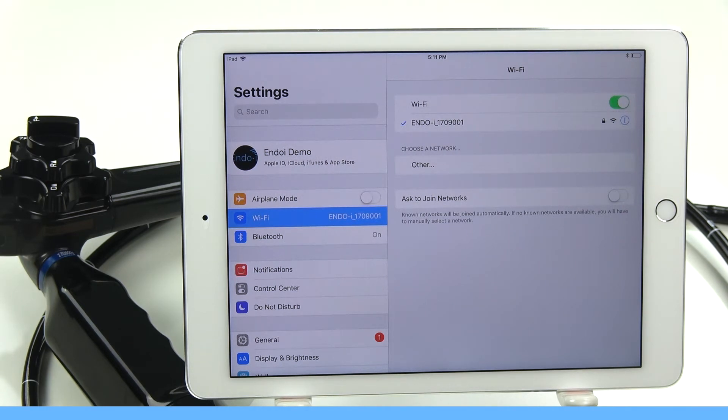While we're still in the Settings menu, let's go ahead and turn our tablet to airplane mode. This helps the EndoI achieve best viewing results.